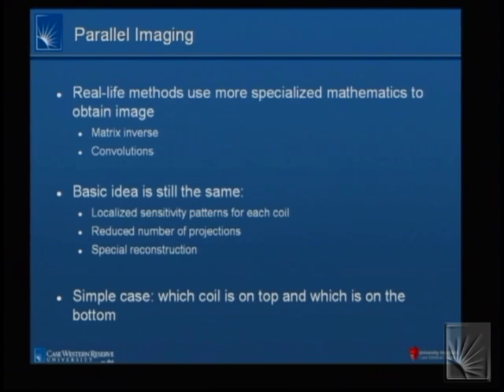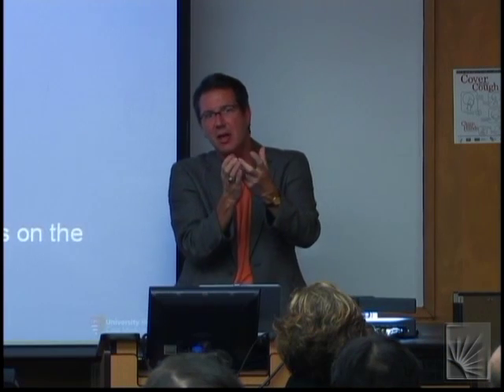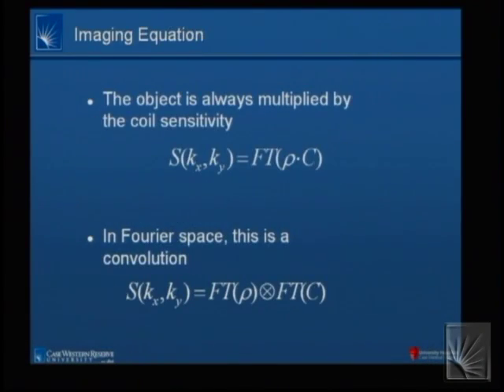Now, the basic idea here is the fact that there is some special mathematics that relate to these particular devices and allow us to put these coils together. Because after all, it would be impossible to make 2 individual coils that each see distinct non-overlapping regions. Once we have some level of interaction, we need to somehow account for the mutual interaction between them.